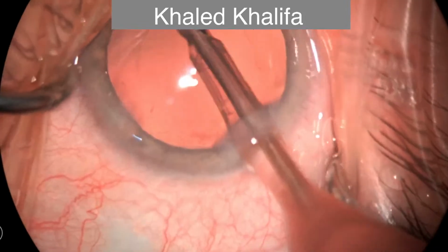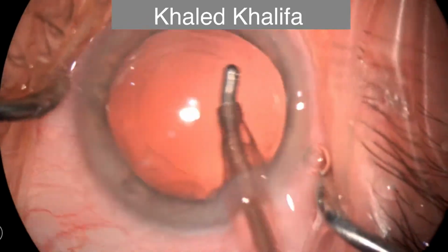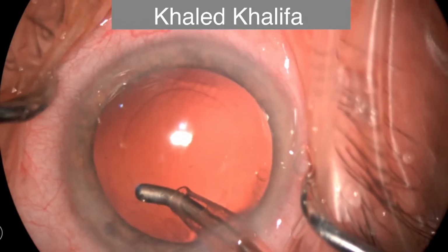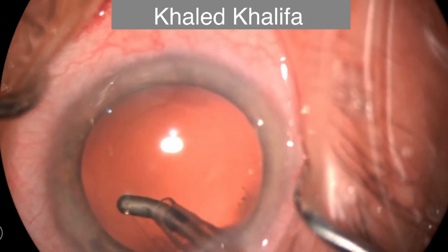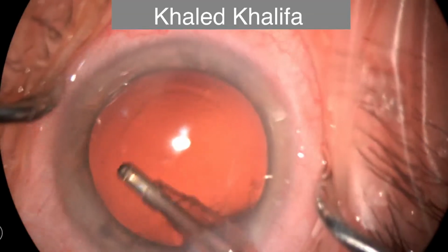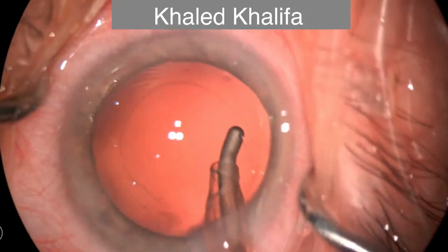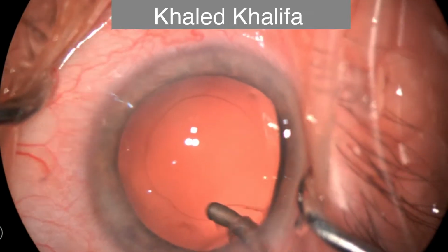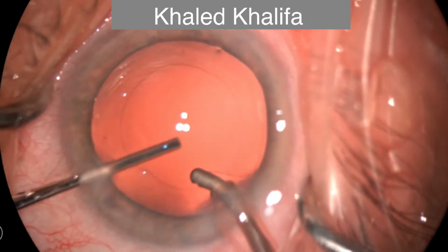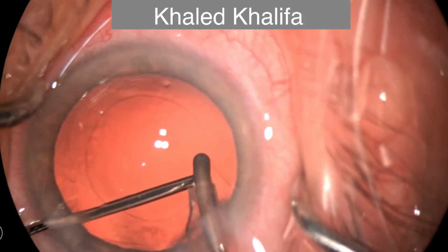And I just remember that this patient has an optic atrophy in the other eye, and most probably this was the situation with the previous surgeon, that due to fluctuation of the anterior chamber he elevated the bottle to the maximum, and this may affect the optic nerve. So whenever I find some fluctuation of the anterior chamber, I don't like to proceed with elevation of the bottle or increasing the intraocular pressure in my case.